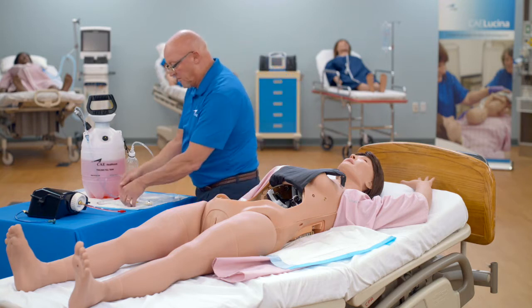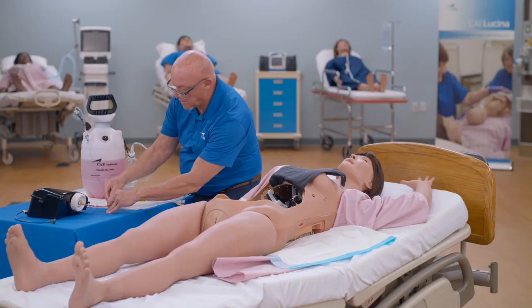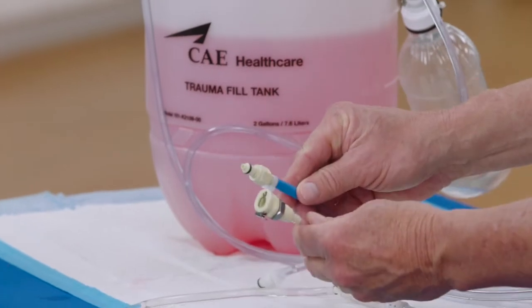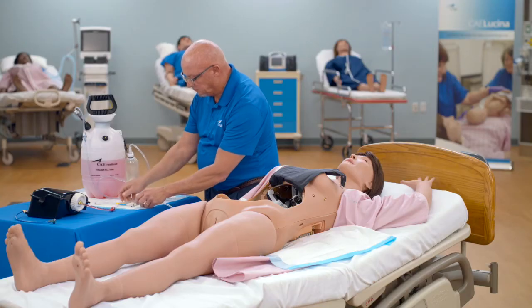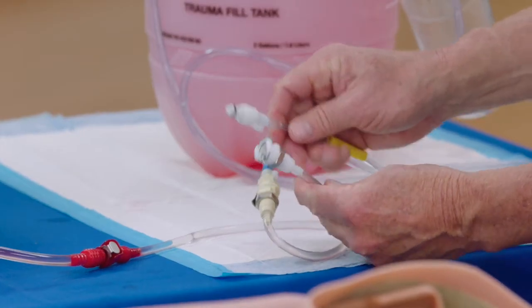Connect the red connector of the blood tank adapter accessory to the red blood tank blood-in tube. Connect the beige connector to the trauma fill tank blood-out port, blue tube. Connect the white connector to the trauma fill tank overflow port, yellow tube.